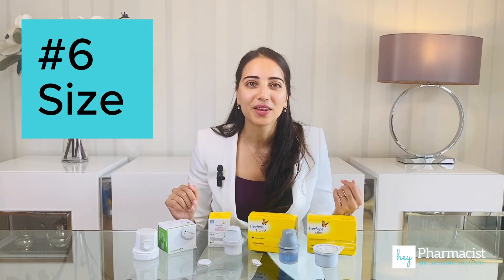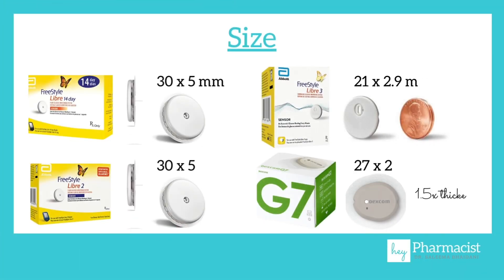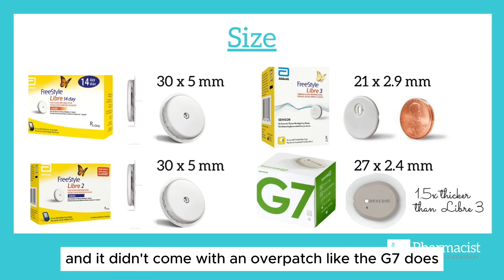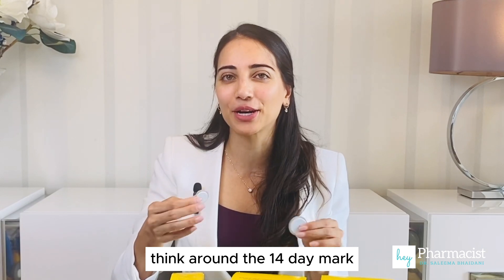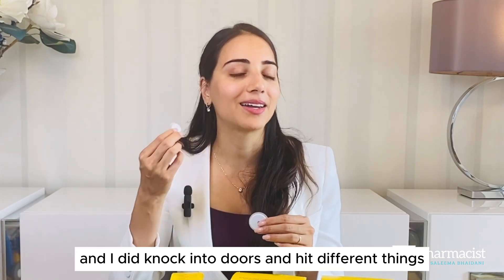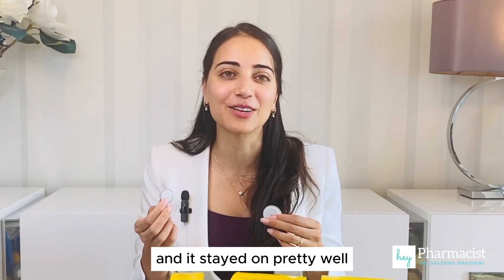Size — how do they compare? Here's a size comparison across all four devices. The Freestyle Libre 3 is the smallest and thinnest of them all, and it didn't come with an overpatch like the G7 does. I found when I used it, it stayed in place quite well. Around the 14-day mark it did start to lose its adhesive, but I didn't have any problems — I knocked into doors and hit different things and it stayed on pretty well.